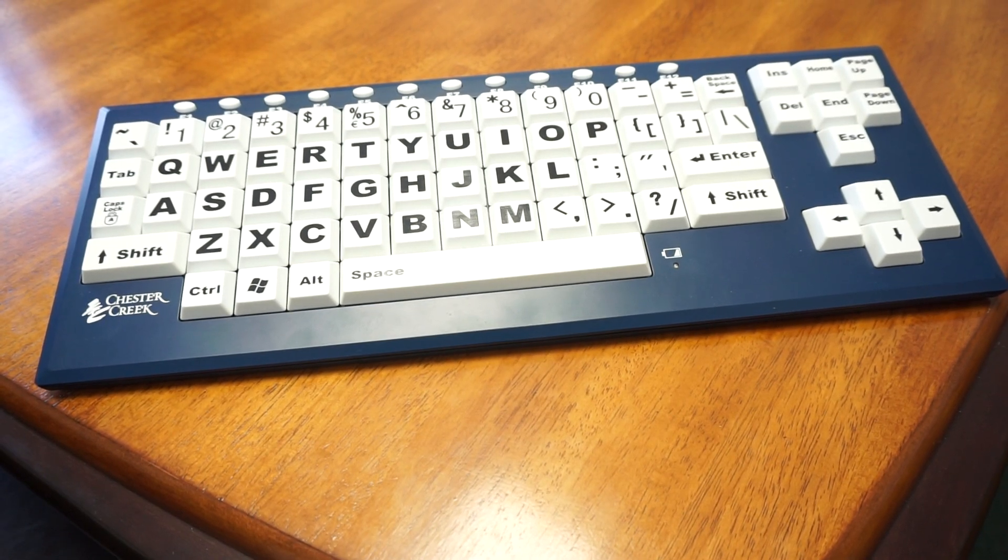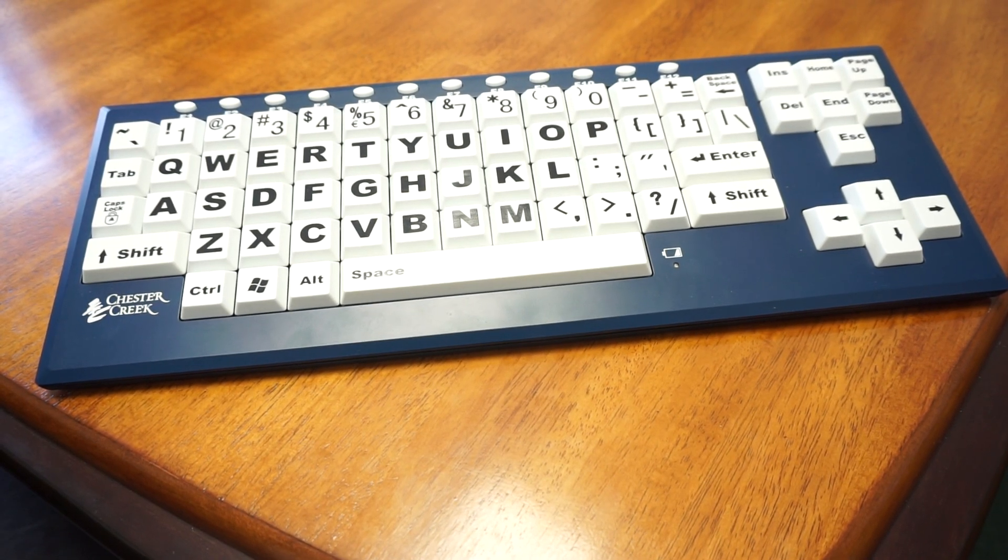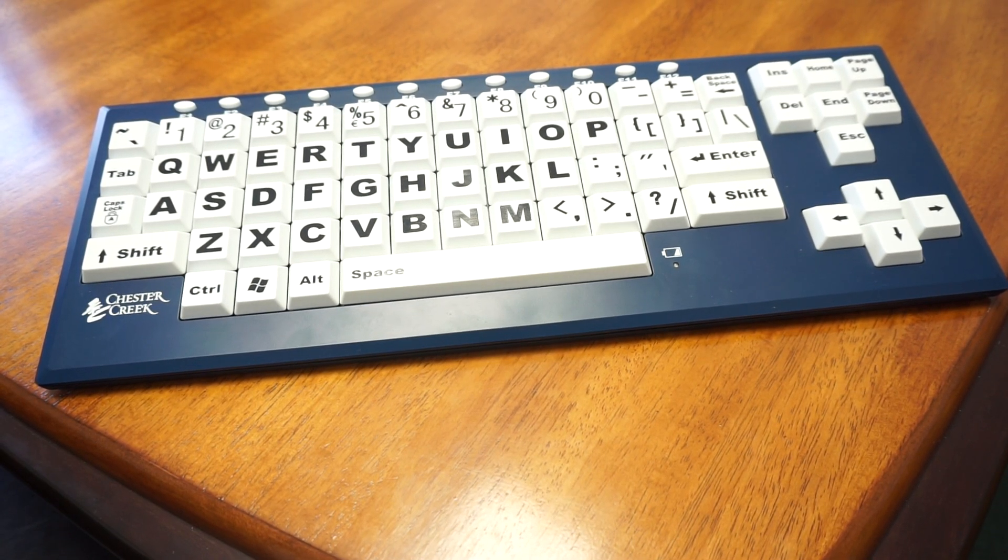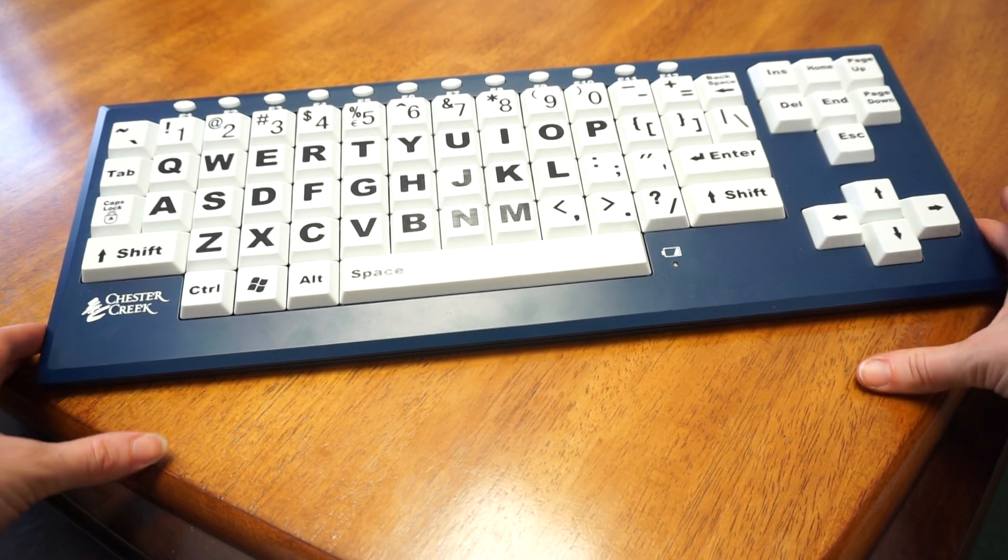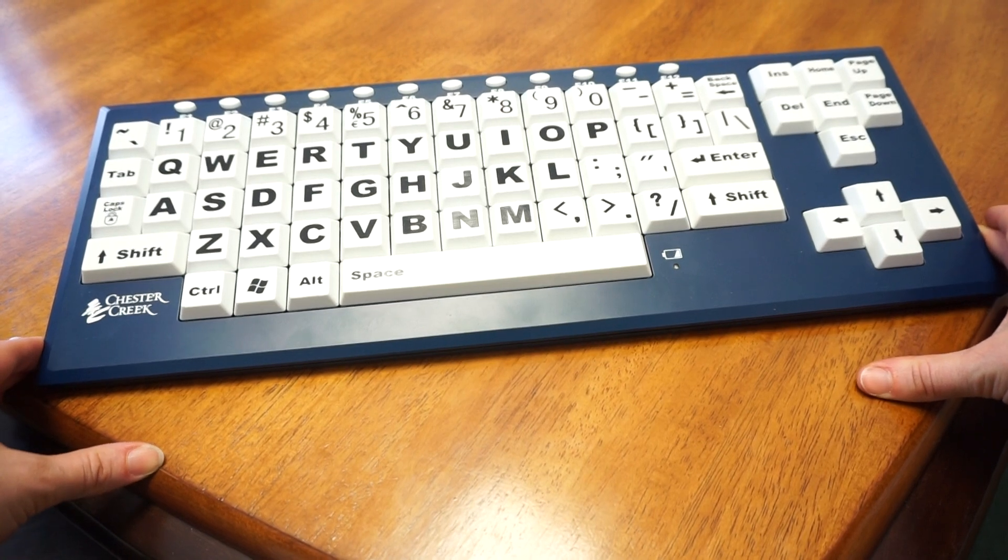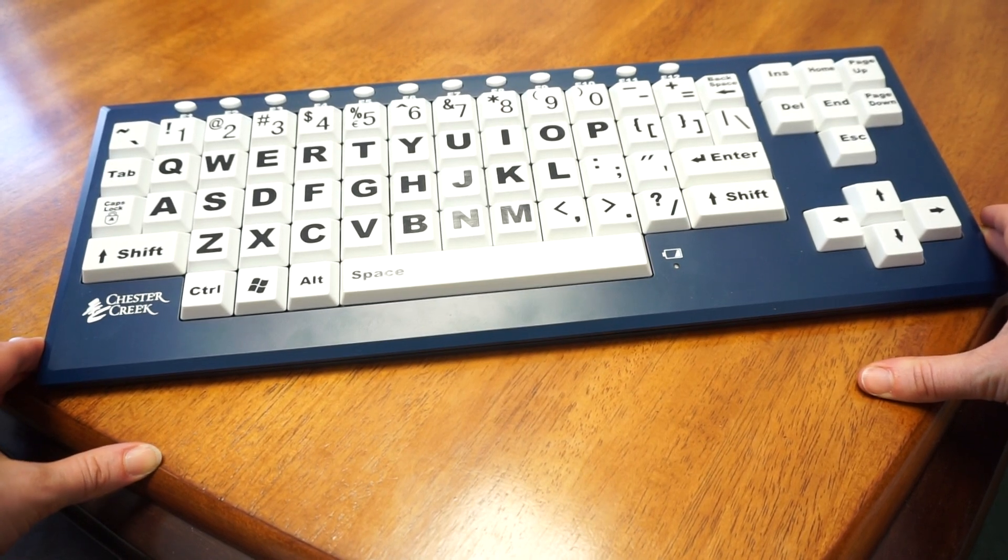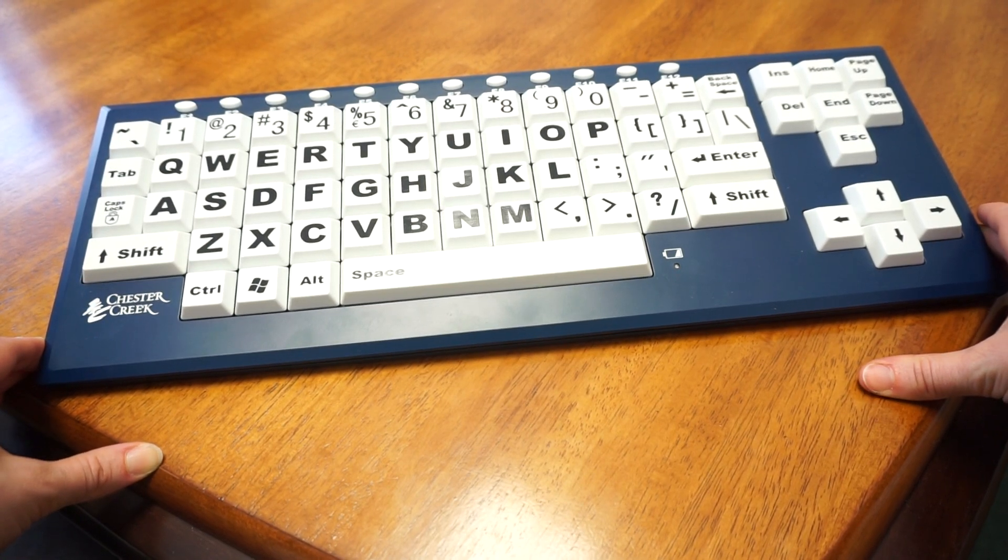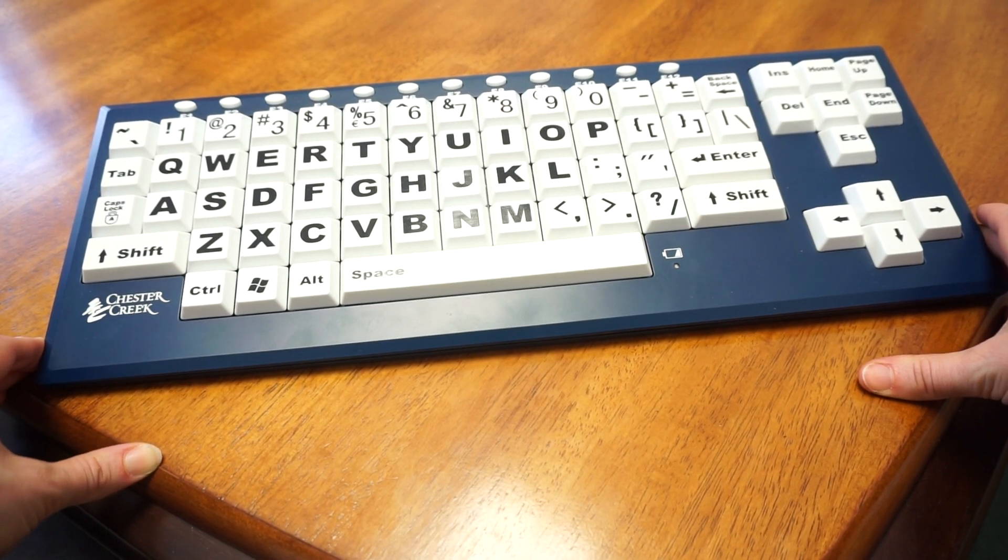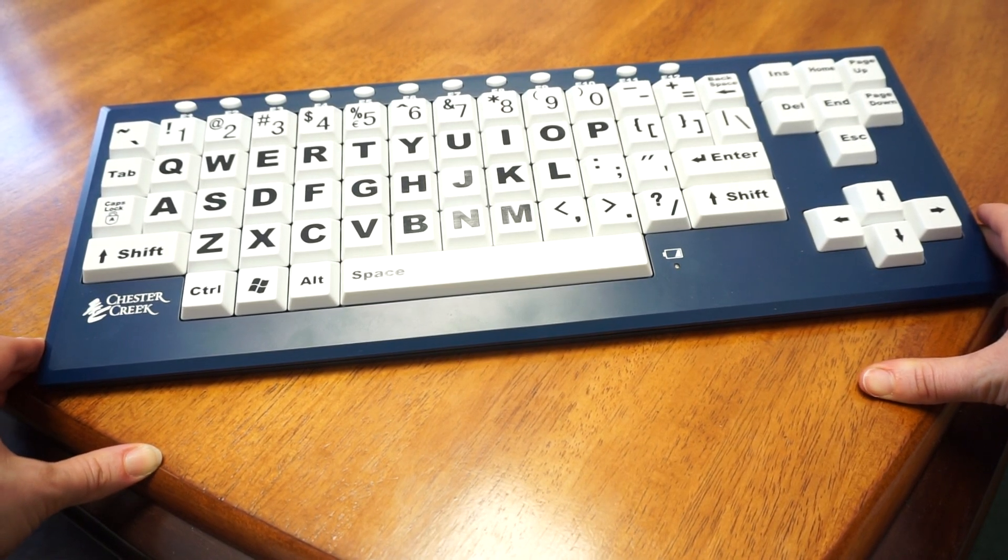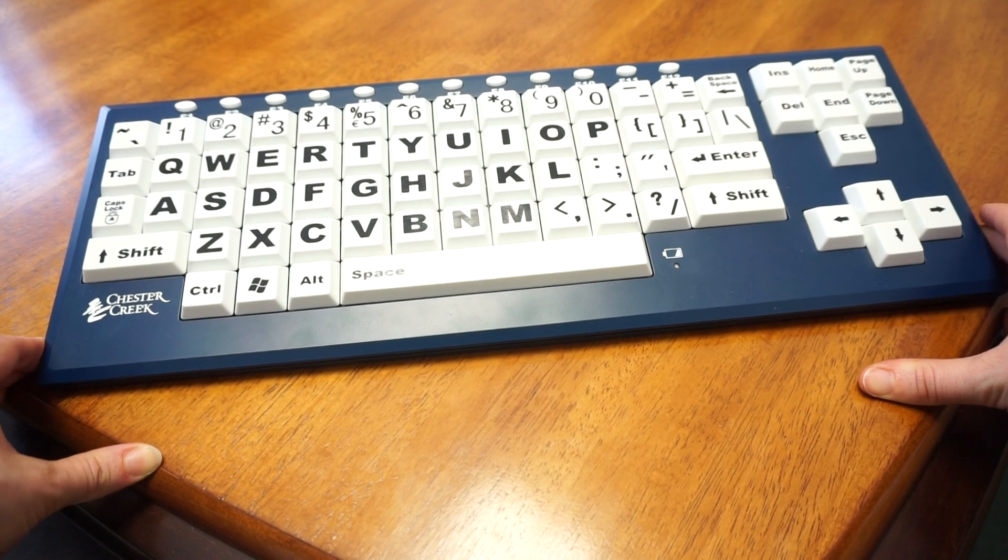This is the Chester Creek Big Blue Vision Keyboard. This is a great keyboard for folks that have low vision or difficulty with fine motor dexterity.